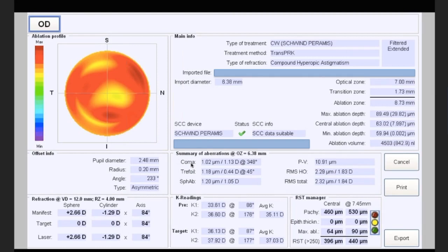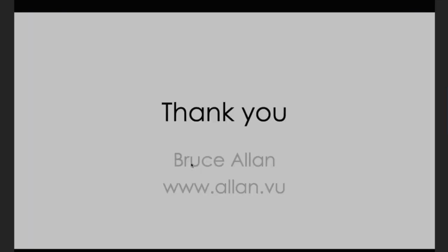You can look at the treatment depth and compare the treatment depth you get with a corneal wavefront guided treatment against the treatment depth with an aberration-free treatment, and there are strategies used to split the difference there. But all of these I find difficult to do personally reliably. And so for me, with the topography-guided treatments, you lose the aberration information from inside the eye, and therefore it makes it more difficult to program and get the sphere and the cylinder right first time. So I think that probably, Theo, I can finish there and leave that open for discussion.